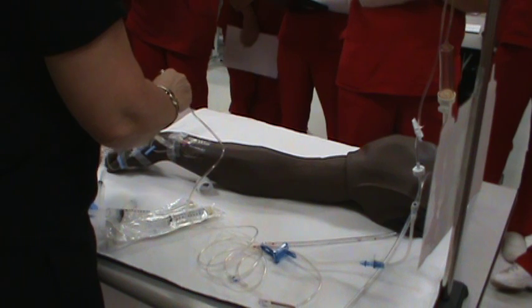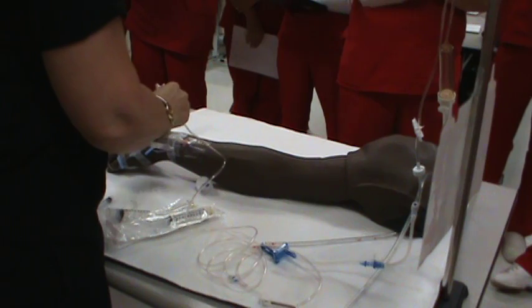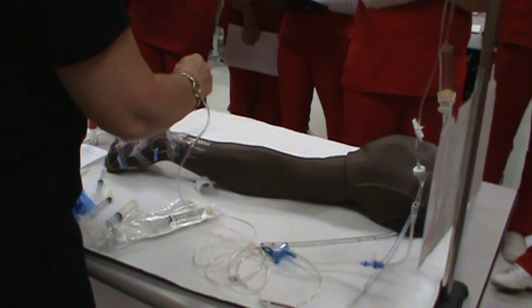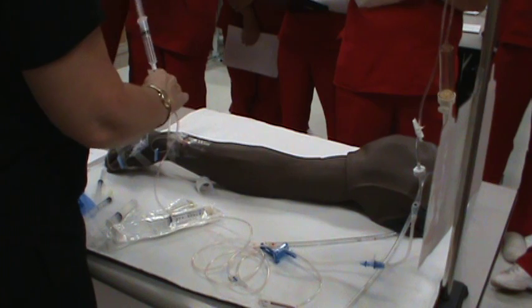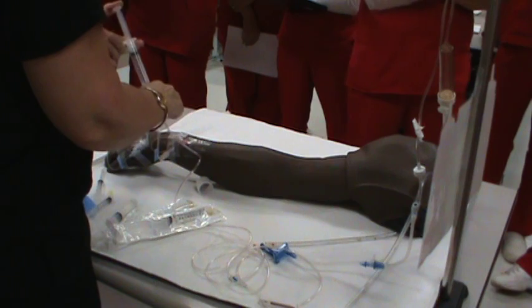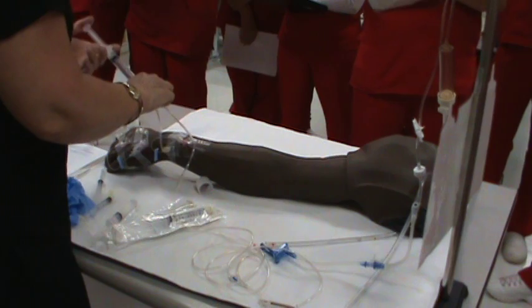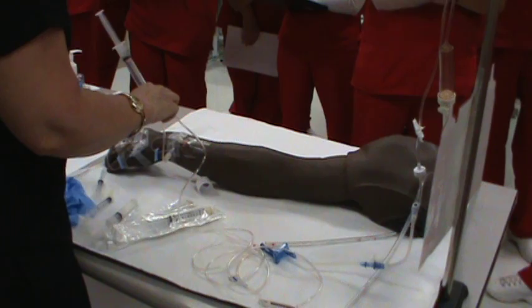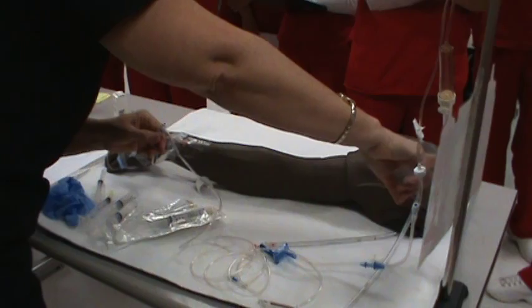And then you can withdraw your syringe. Clean it. Then your flush. Attach your flush. How fast does that go in? Same rate. Same rate. You want us to do the full 10 or how many mLs? Just 3 mLs? It would be 3 mLs per minute, 3.33. So then you push that in, same rate. And then detach that, restart your IV.